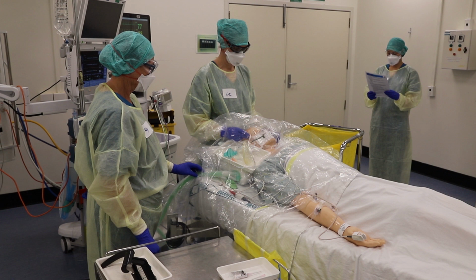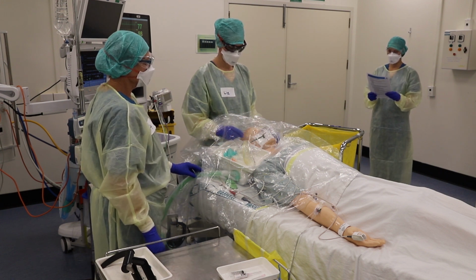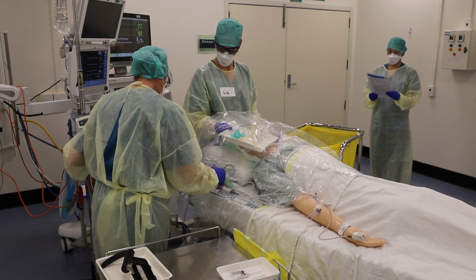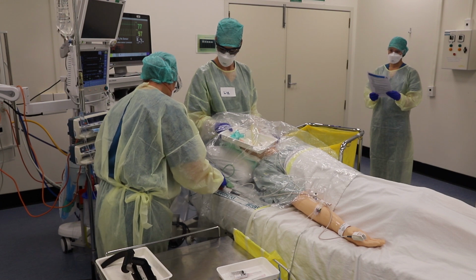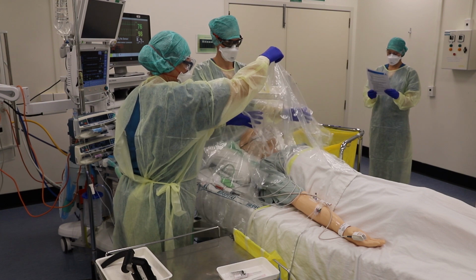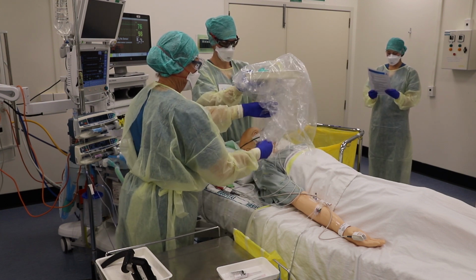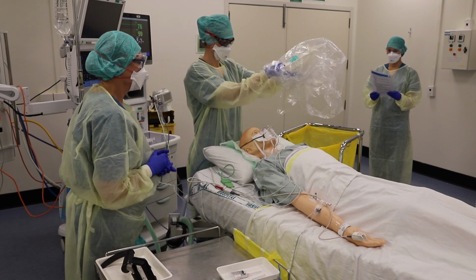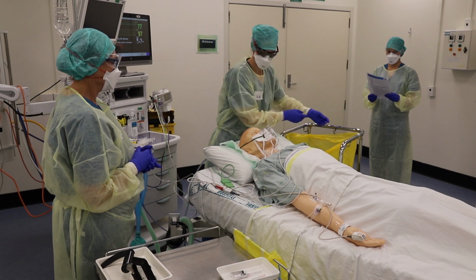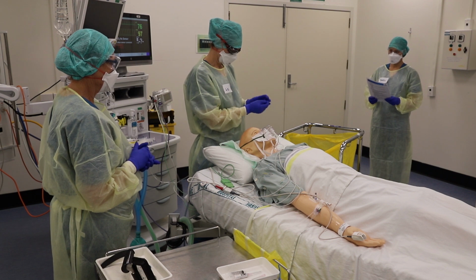When ready, tech slowly and carefully lifts plastic sheet from centre while anaesthetist picks up dirty tray. Plastic sheet is carefully folded in on itself by anaesthetist enclosing the tray and immediately placed in bin with minimal folding. That's complete. Remove outer gloves, perform hand hygiene and re-glove.